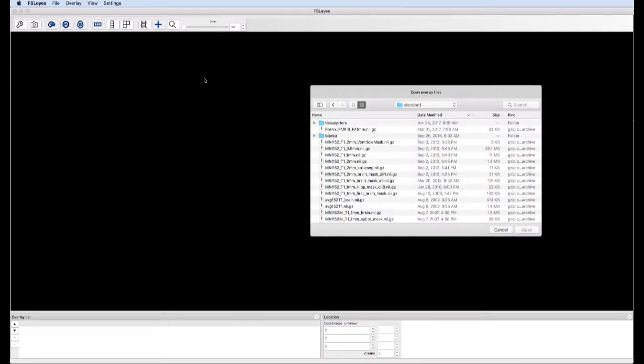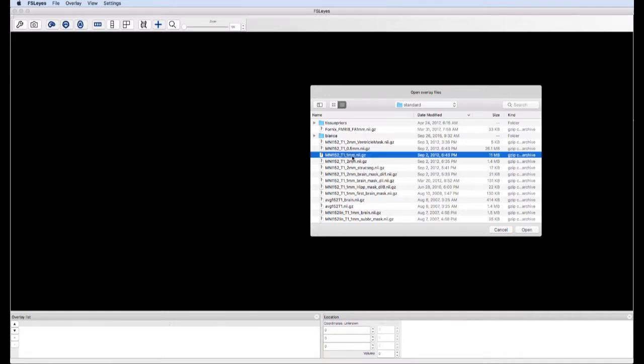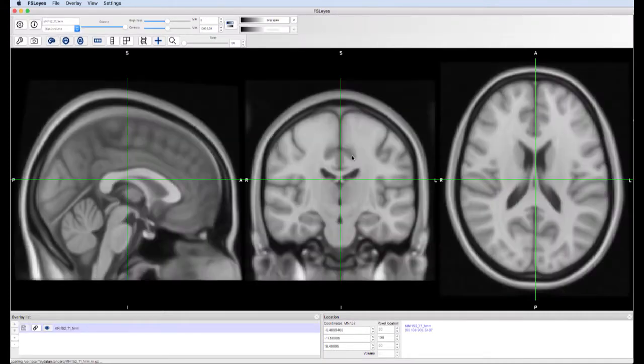First, open up a template image by clicking File, Add Standard, and selecting the MNI 152 one millimeter brain.